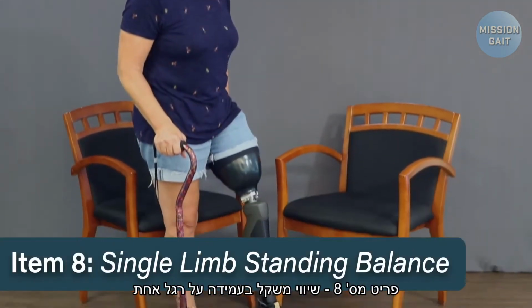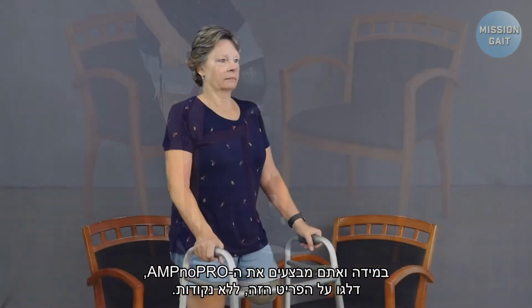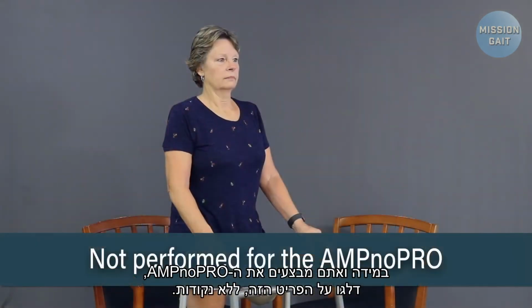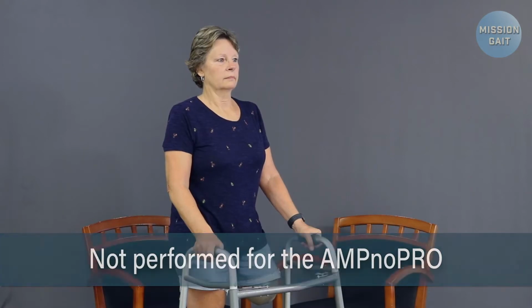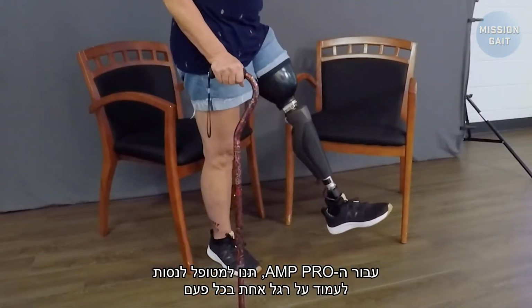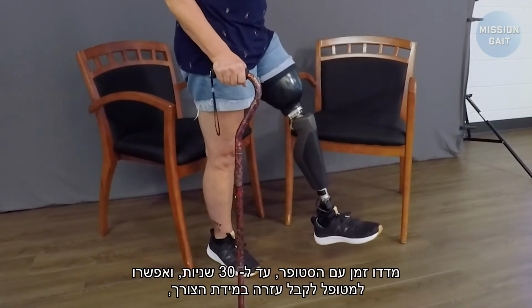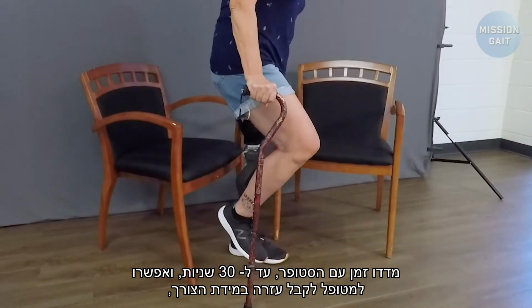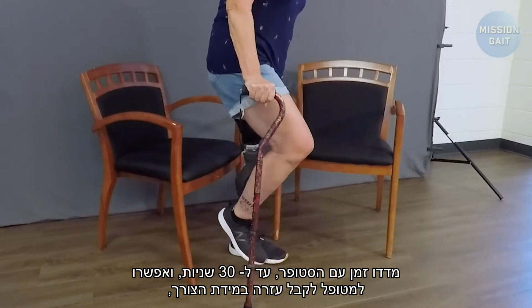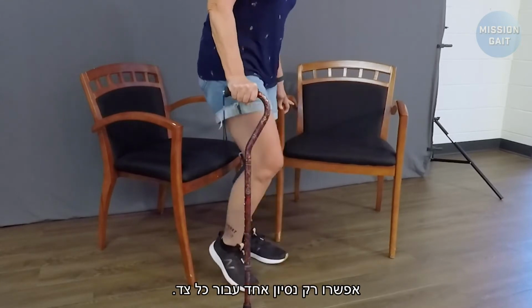Item 8. Single limb standing balance. If performing the AMP No Pro, skip this item, assigning no score. For the AMP Pro, have the patient attempt to stand on one limb at a time, performing the task on both sides. Time the patient using your stopwatch up to 30 seconds, allowing the patient to use assistance as necessary. Allow only one trial on each side.